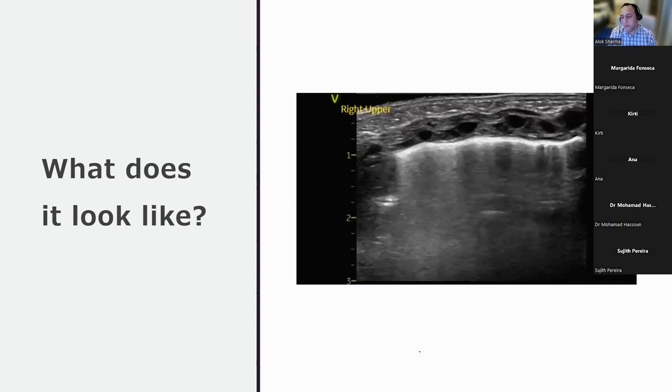Lovely. So this is a 24-week baby who, from my perspective, was intubated, ventilated, had two doses of surfactant, was actually in air for the first 48 hours, was honeymooning on antibiotics with a normal CRP. And at about 72 hours, my FiO2 has gone up to about 30-35%, a gradual increase. So before doing a chest X-ray, I have decided to do a lung ultrasound. And this is the lung ultrasound as you can see it. I'm just going to take my laser pointer off.